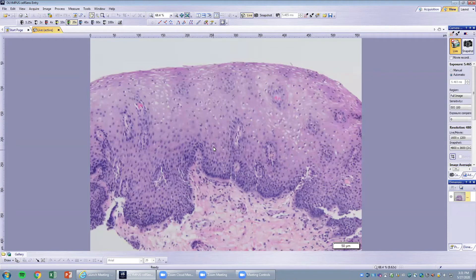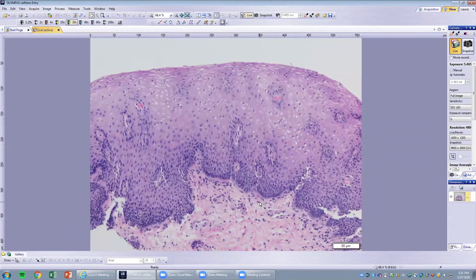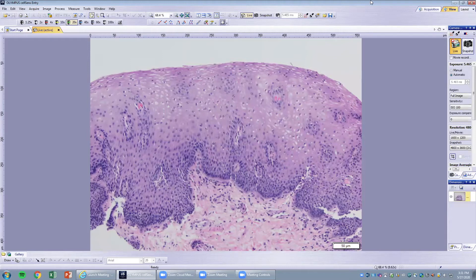At the surface, the epithelial cells are maturing to the surface. There is no inflammation whatsoever in this epithelium — no parakeratosis, no eosinophils, nothing. So we can consider this a normal esophageal biopsy.